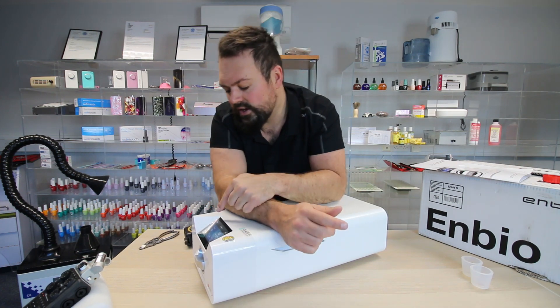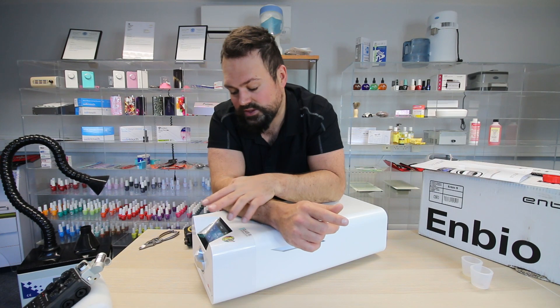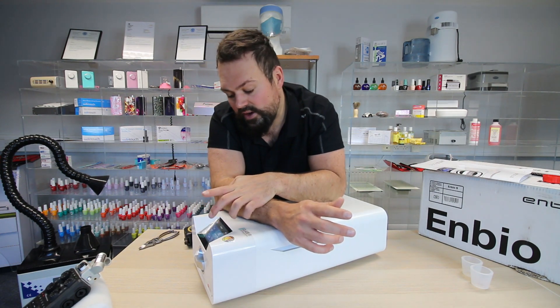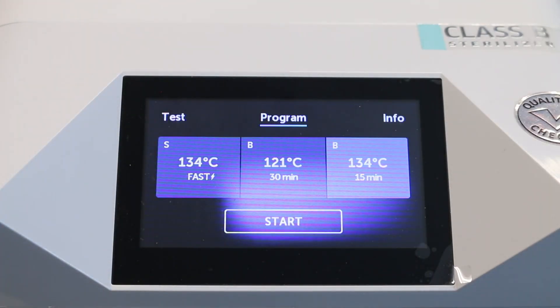So you've run your first tests — vacuum and helix — and now you're ready. Each test takes about 10 to 15 minutes. Once the tests are over, you're ready to start actually using the device. You can click on programme. It's very, very easy.